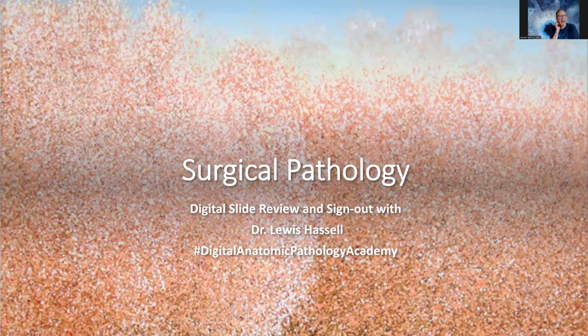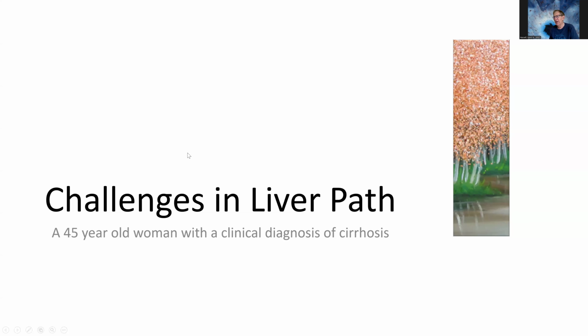I'm very pleased today to have quite an interesting case from our recent experience and wanted to share that with you. The patient is a 48-year-old woman who has been followed on our hepatology service and suspected of having cirrhosis. So that brought to my mind a question about what else could it be, particularly since in this case it did not turn out to be cirrhosis. So let's take a look at that. Actually, she's 45. I take that back.